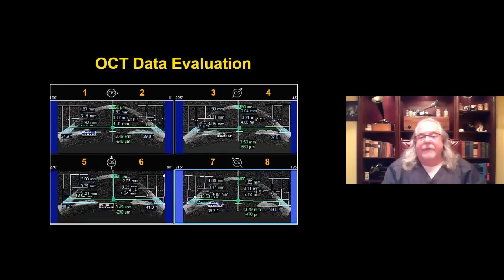Once again, these numbers were not arbitrarily chosen. They were some backbreaking work done by our researchers at Pacific University that evaluated a large number of corneas to actually come up with these all-important scleral radii data.